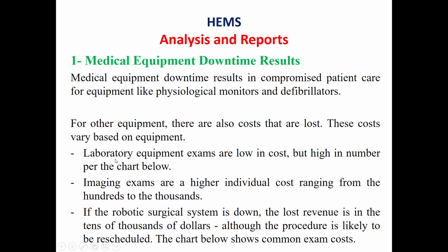For example, in the case of laboratory equipment, exams are low in cost, but a high number will make the cost higher. For example, a test will be around $10 or $7, but a large number of tests will be performed in the laboratory equipment.